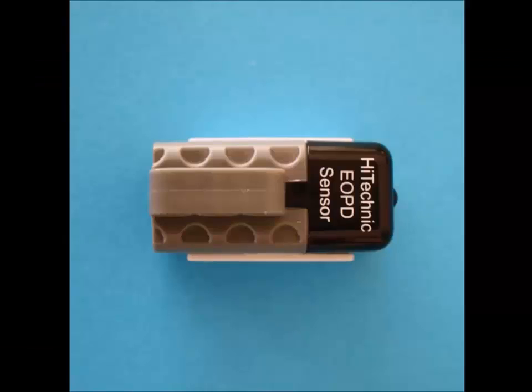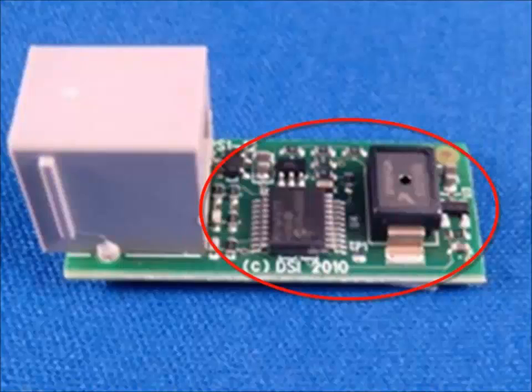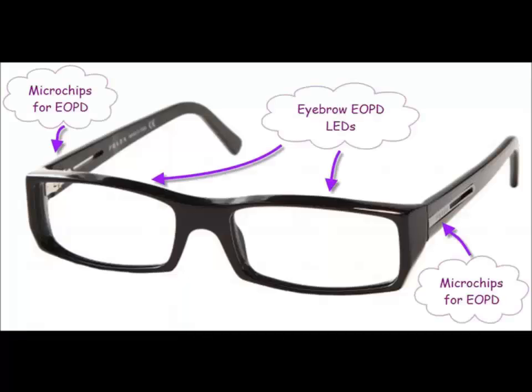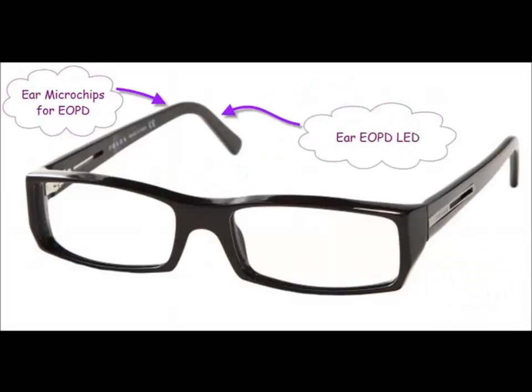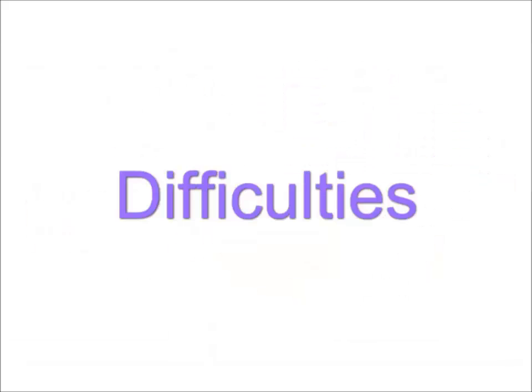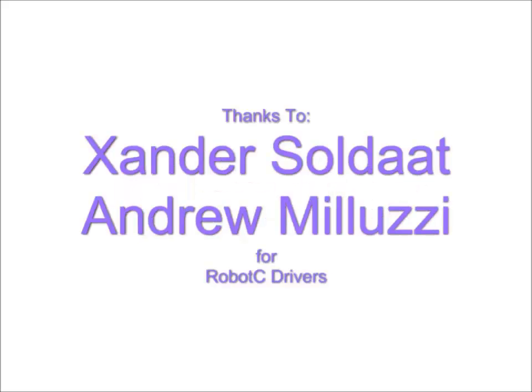While LEGO sensors can be big and clumsy, the electronic components inside are only a few millimeters thick, and can easily be built into a pair of thick-rimmed glasses. Eyebrow sensors here, ear sensors here, NXT radio here. The nose sensor worked, but the movement is probably too small to be reliable. We only had two EOPD sensors instead of the four needed, so we had to test in halves.